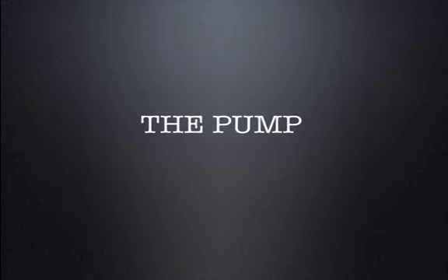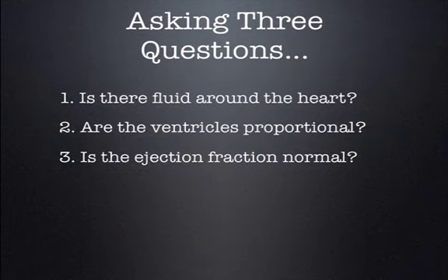So let's talk about the pump now. And really, when we're talking about evaluating the pump, we're not talking about a comprehensive echocardiographic evaluation. We're talking about three simple questions. And that is, is there fluid around the heart? Are the ventricles proportional? And is the ejection fraction normal?